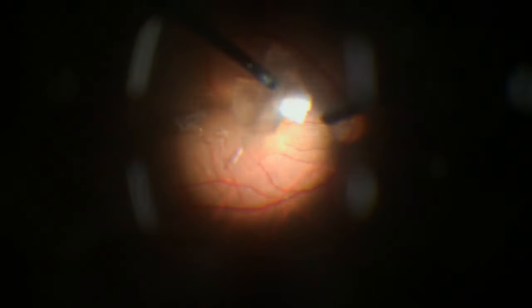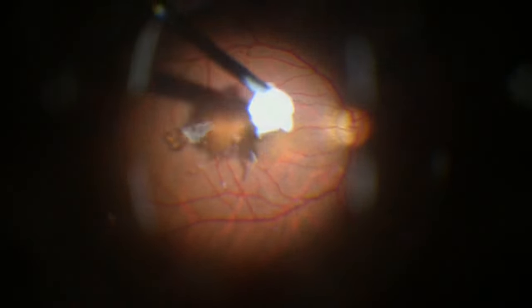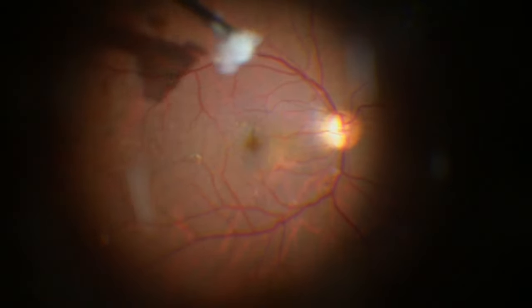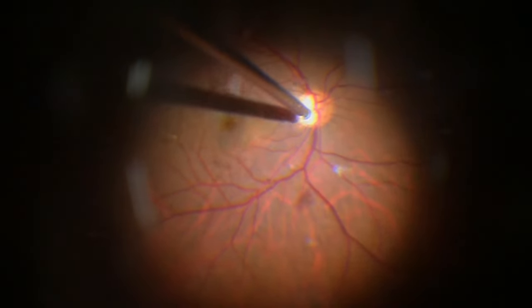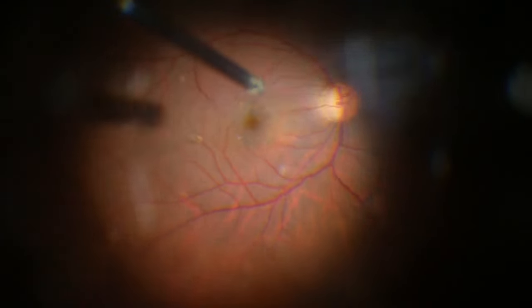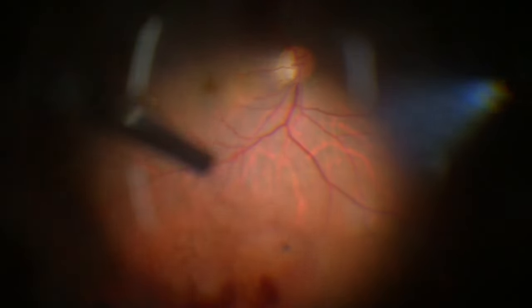The light pipe can also assist in stuffing the nuclear pieces into the cutting port, facilitating the removal of the lens. Once the lens is removed, we must ensure that a posterior vitreous detachment is induced and the remaining cortical vitreous attached to the retinal surface is removed.